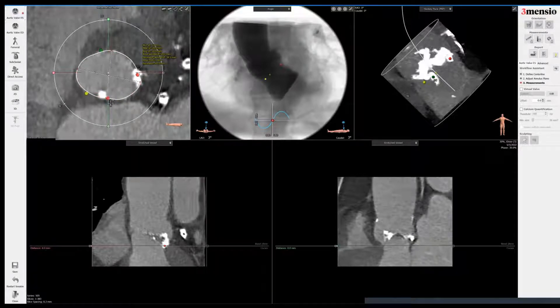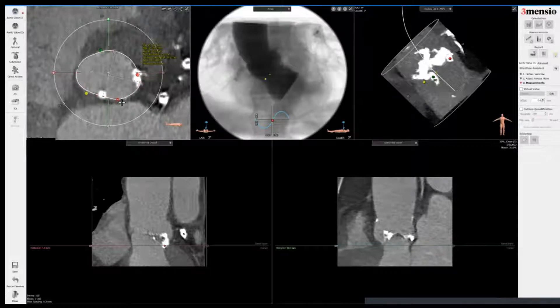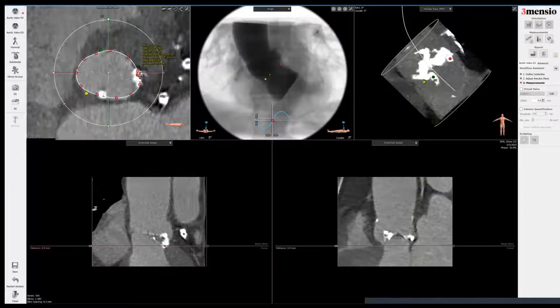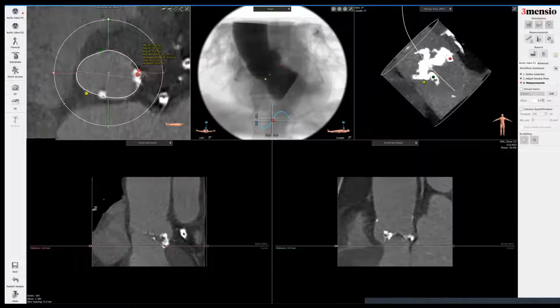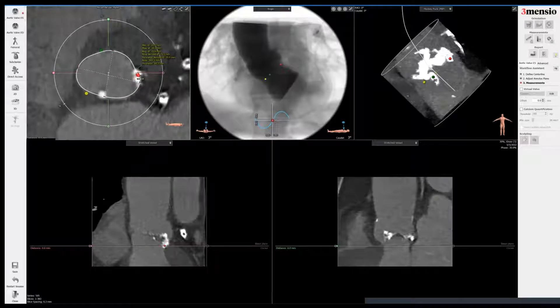I don't go outside either. If you go outside, your area is now overestimated — you get 515 or so, now it's 522. That can matter in terms of sizing strategy and also root rupture risk. So I typically like to just cut right across as much as possible to preserve the contour of the annulus. If I'm a little bit tight here, and sometimes if you have a lot of blooming, it's advantageous to right-click to make it a little darker to reduce blooming artifacts. So just cut right across the calcium — don't go outside. If you go outside, area increases; if you add dots inside, perimeter increases but area decreases. Just something to keep in mind when you have annular calcification, which is quite typical in bicuspid valves. I do the same thing as I would in a tri-leaflet valve.